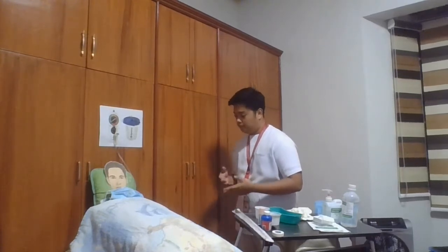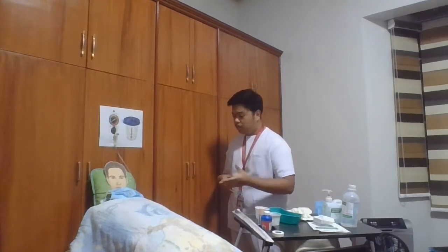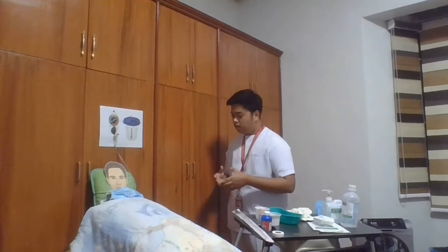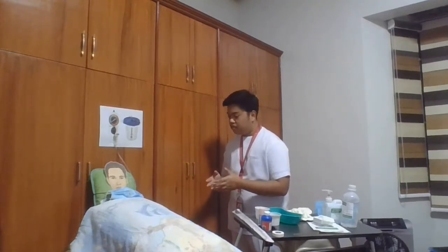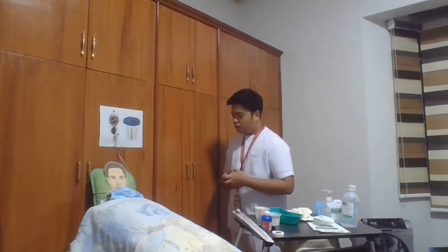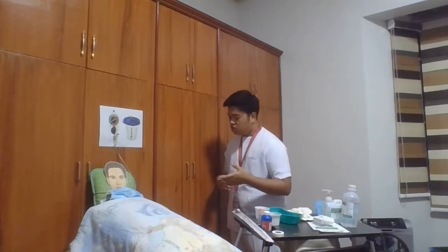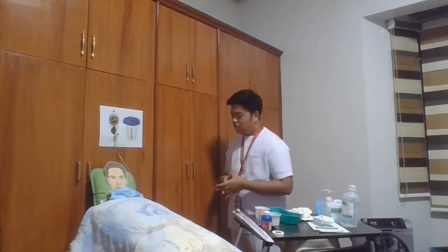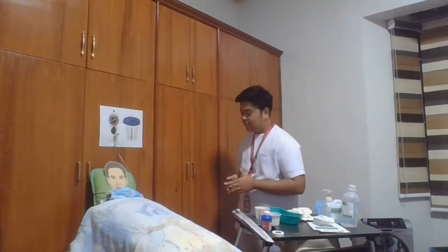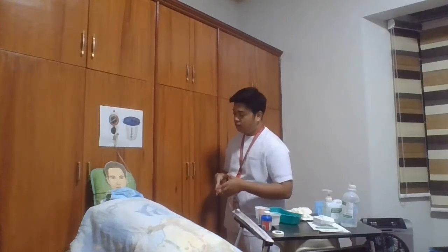Good day sir, El Guapo. Today we will perform a tracheostomy care to keep your tracheostomy clean. This procedure helps prevent your tube from clogging and it also decreases your risk for infections. In addition, we will also perform suctioning to remove the thick mucus and secretions from your trachea and lower airway. You just need to relax and tell us if the procedure becomes uncomfortable. Is that okay with you sir?